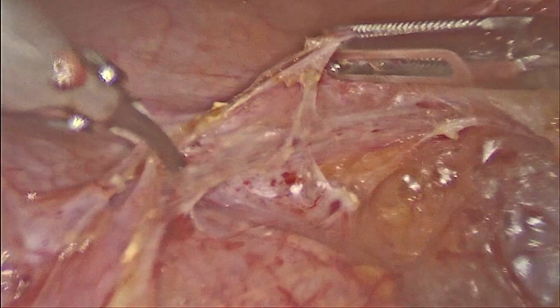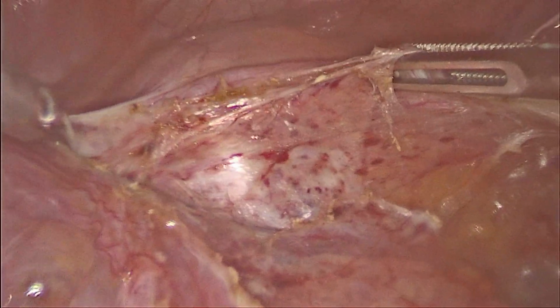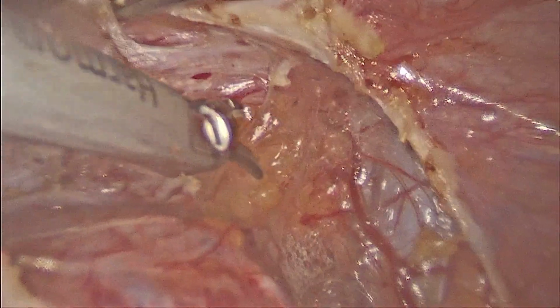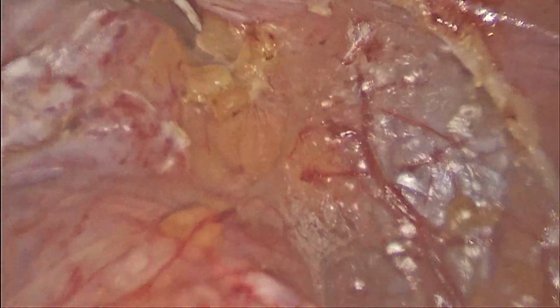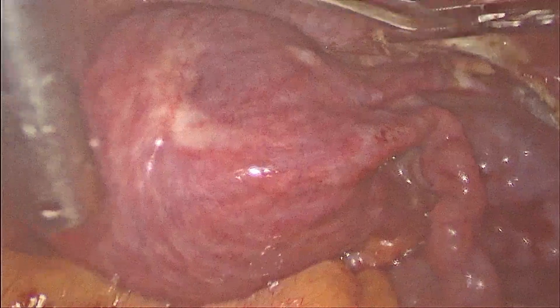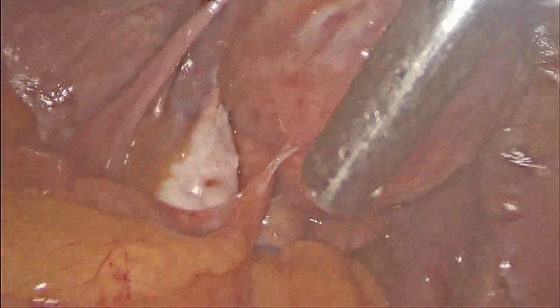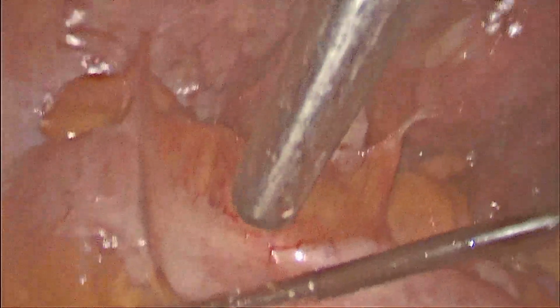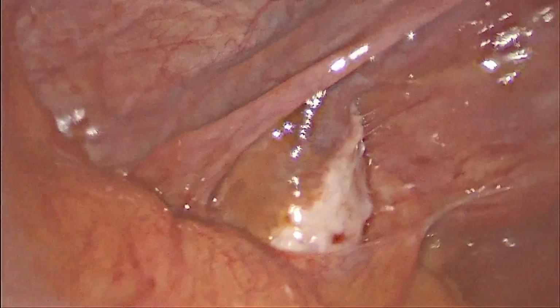Keeping the surgical field clear and dry is very important in these cases to get exposure of the underlying structures. A small amount of bleeding will stay in this area and you will find it a little more difficult, but it is not possible all the time to have a clean and dry field. Sometimes it may be messy, it may be stained. So now we can see that even the sigmoid colon is adhered to the lateral pelvic wall more than the routine adhesions, and also the sigmoid colon is adhered to the left side of the adnexa.